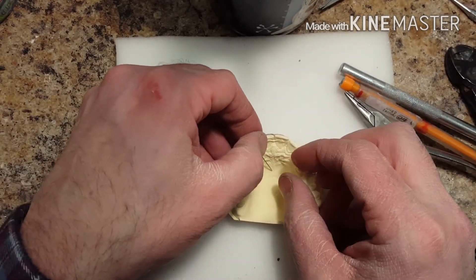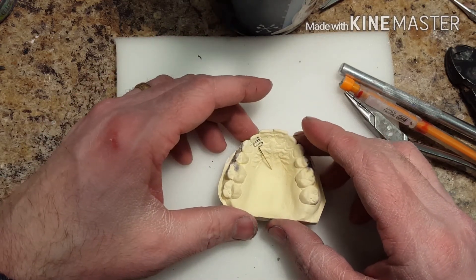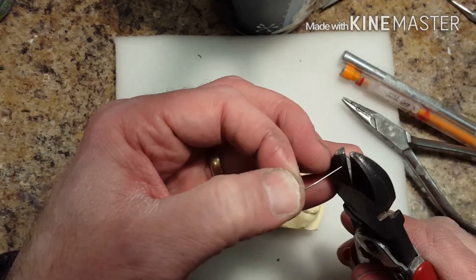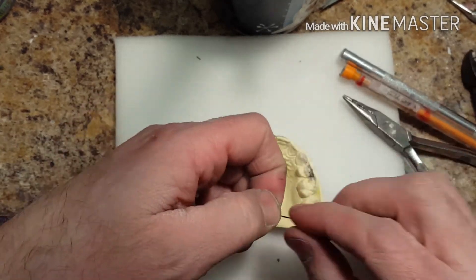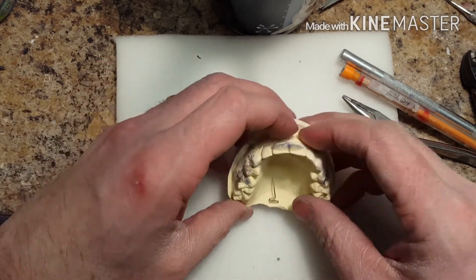The key to making these types of springs is to make sure it's about a half a millimeter off the tissue to allow the acrylic to flow underneath. Otherwise, you're going to run into problems where it's going to be poking into the gingiva.